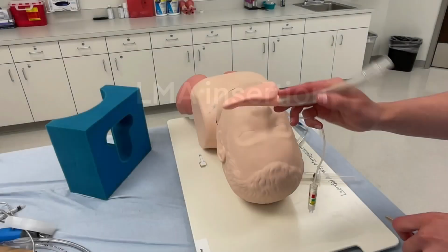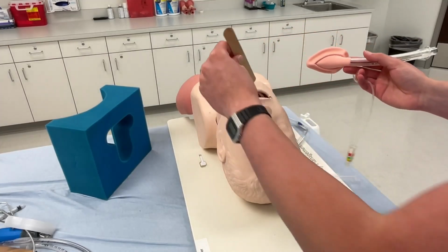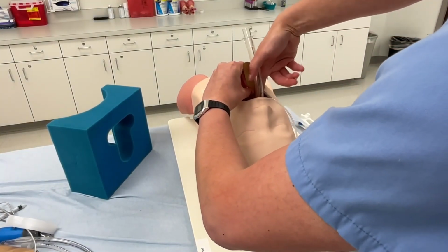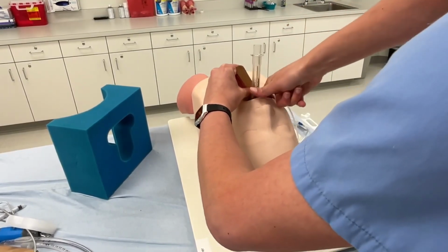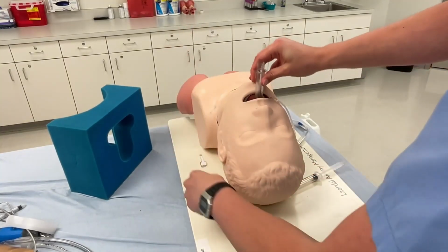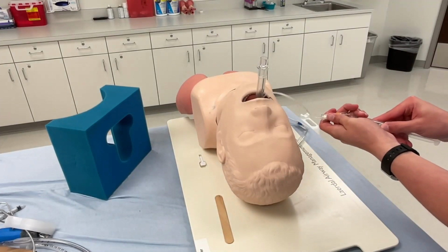Now for LMA insertion. Again, this is another plastic/rubber device, so it's going to get stuck and it's going to be a pain. Tongue depressor, get the tongue out of the way, using the Archie Brain technique, pushing down as hard as I can, tracing with that index finger up the hard palate, down the soft palate, and into the back of the throat. Again, because it's a mannequin, I'm having to really shove it in there. Going to inflate that cuff.